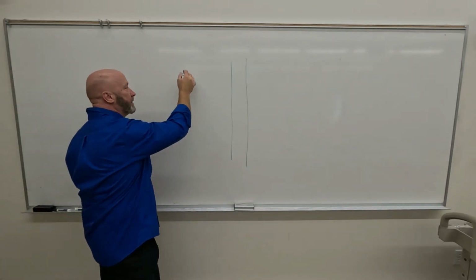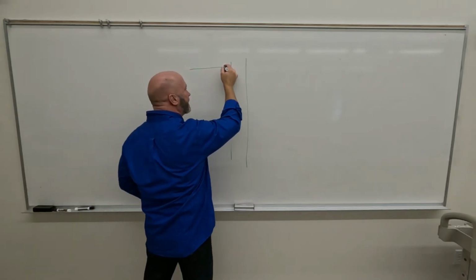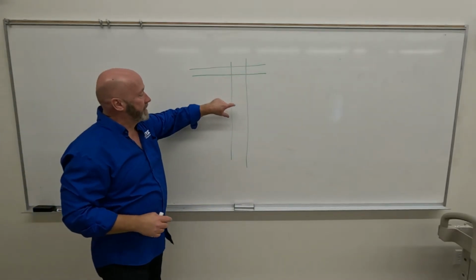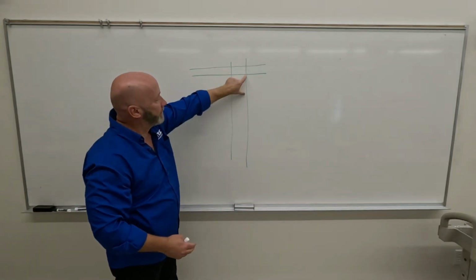And it's got another set of rails that goes, I'd say, about 2/3 of the way to the sink and almost to the wall on the other side. So 2 sets of rails, total of 4 rails. So these are stuck to the ceiling, and then these roll on those.